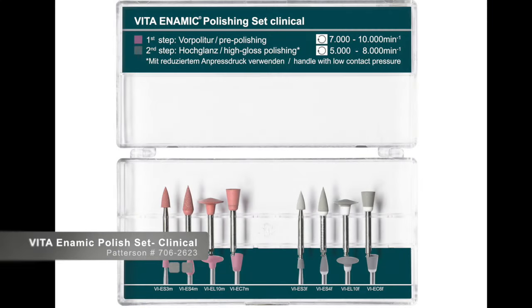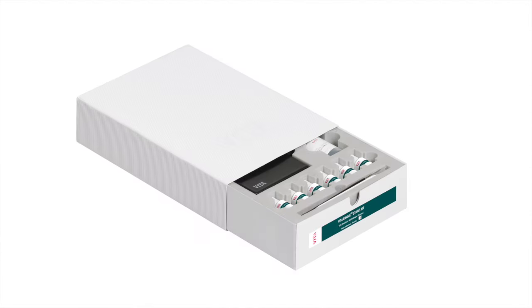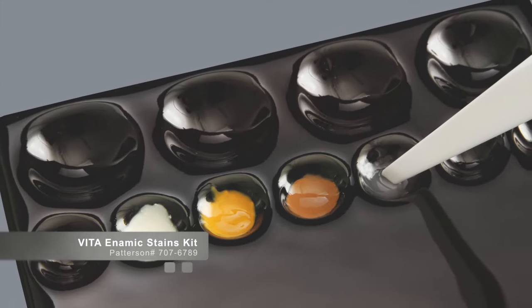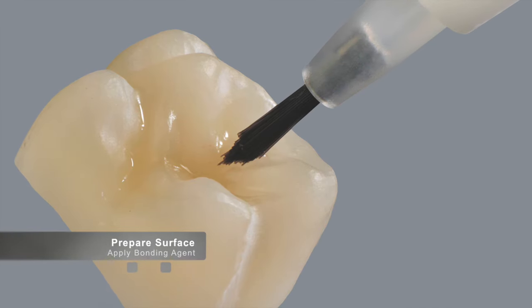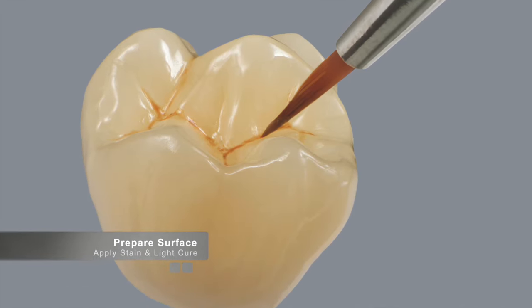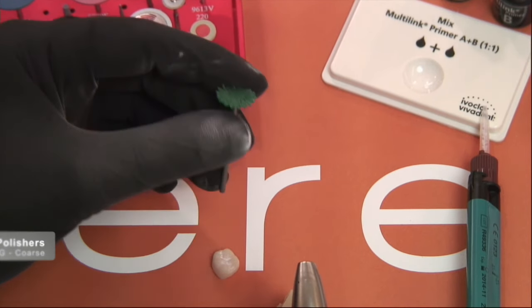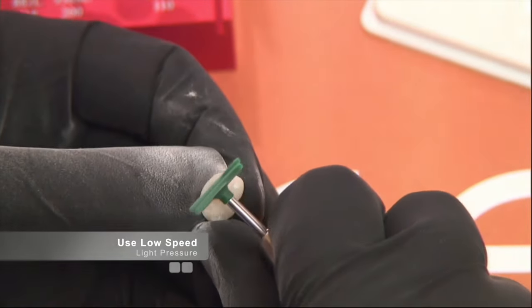Using the 863 burr, you can define anatomy a bit prior to polishing. Vita also makes a polishing kit meant for chairside use — the clinical kit, with the Patterson number listed — and they also have a technical kit meant to be used at low speed in the laboratory setting. You can also stain and glaze Enamic; Vita makes a light-cured stain and glaze kit. You would hydrofluoric acid etch the restoration first, apply surface treatment, apply stains, and light cure. Most users, however, choose to polish the Enamic material since it's more predictable and easier.